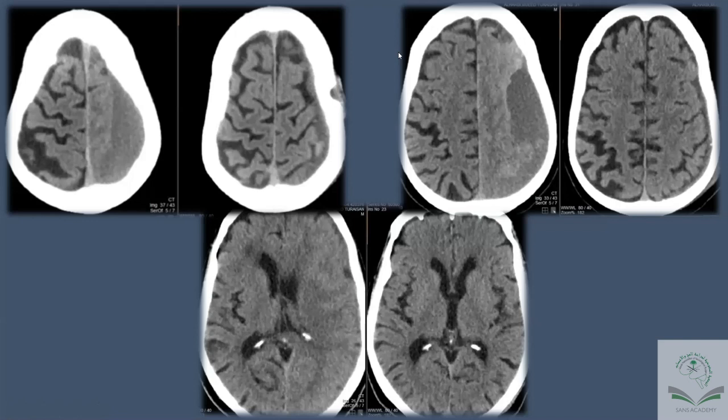For bilateral hematoma, I did not come across the endovascular option until now. But I guess that if I was faced with a case tomorrow, my decision would be the same. If it is indicated, if the patient is not in emergency for immediate evacuation, then we can do it for both sides at the same time through the same approach, which is radial. You can do the right side and the left side. And on the contrary, when you are doing the burr hole, I personally prefer to do skin incision on both sides, and then the burr hole on both sides, and then simultaneously, two persons pop the dura at the same time. Is this necessary or not? Actually, I cannot tell you, but this is my practice. I pop them at the same time.